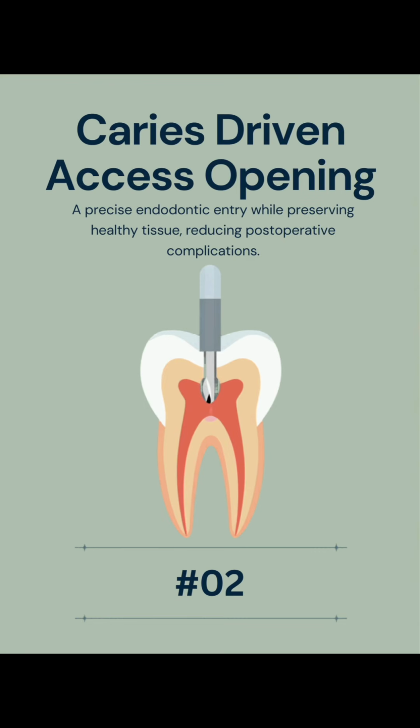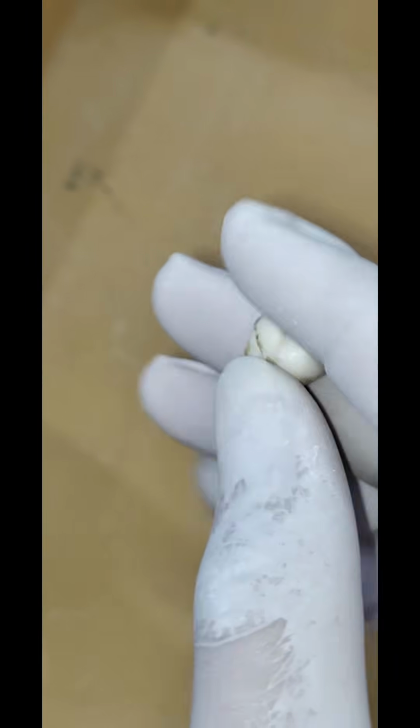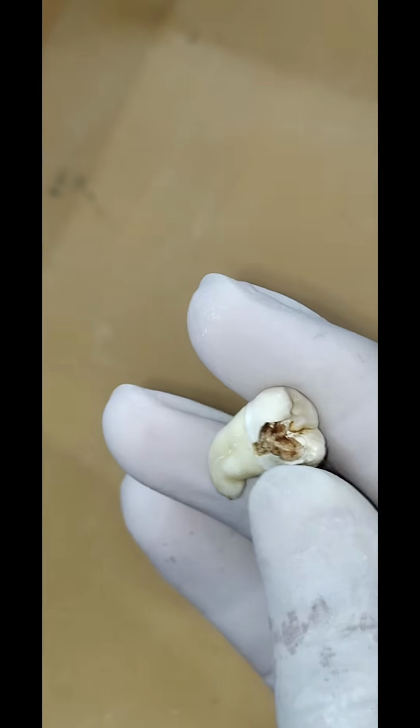Hello everyone. So this is the second video in our series, and today again we have a lower molar, but this time a second molar again which has very curved, dilacerated roots. So let's start with the access opening now.